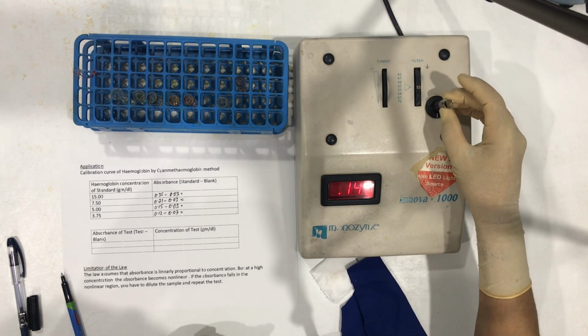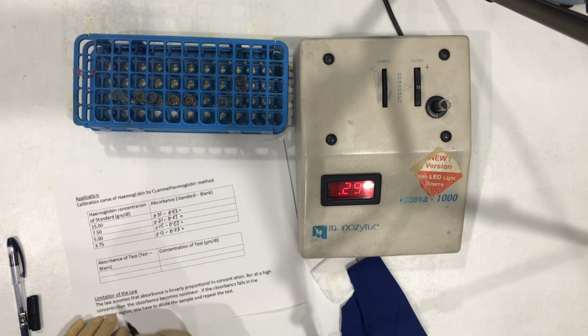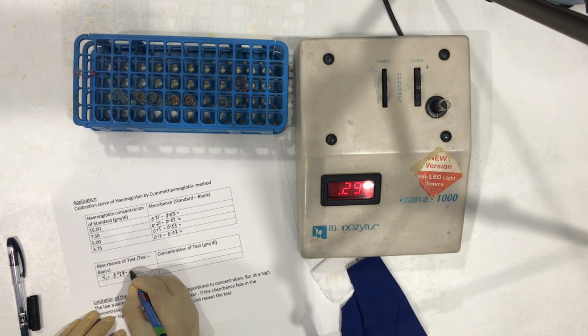Sample S1 is giving absorbance of 0.29. S1 is giving absorbance of 0.29 minus blank 0.03.